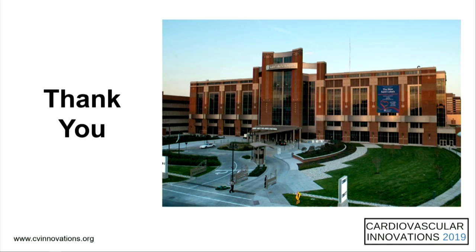There were a couple of strokes in that 66 patient series. We get stroke with TAVR, so we don't know if it's a result of BVF itself. We did have one case where this was before we fully understood. We talked a little about the maximum balloon size with a CoreValve. Early on, I didn't know that we were limited in terms of the size of the balloon we could use, and we did injure acutely one CoreValve and had to place another valve.